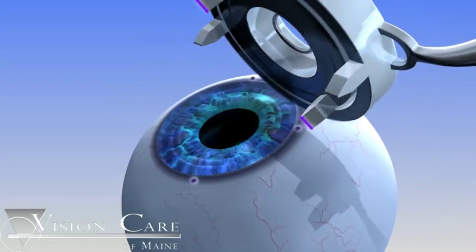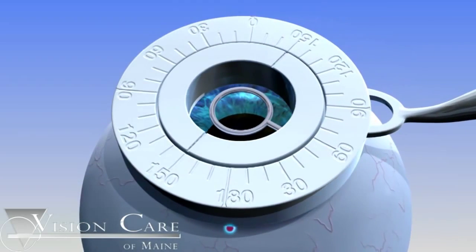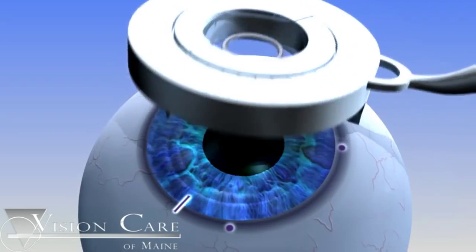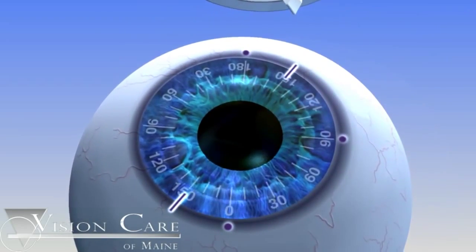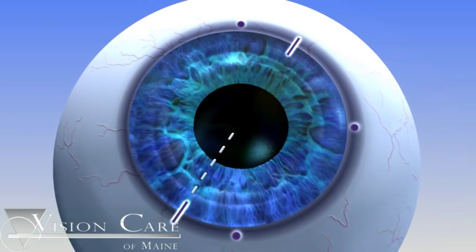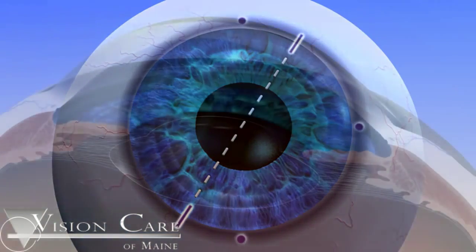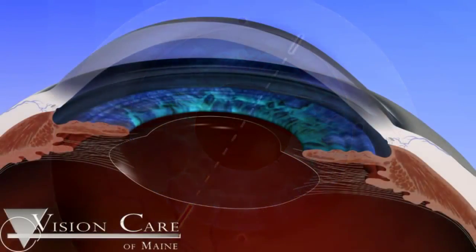The footplates are then inked using a surgical skin marker. Using the 0, 90, and 180 degree marks as reference, the surgeon aligns the axis marker and gently depresses the instrument onto the cornea. This produces two linear ink marks at 180 degrees from each other, which represent the location of the steep axis of the astigmatism.